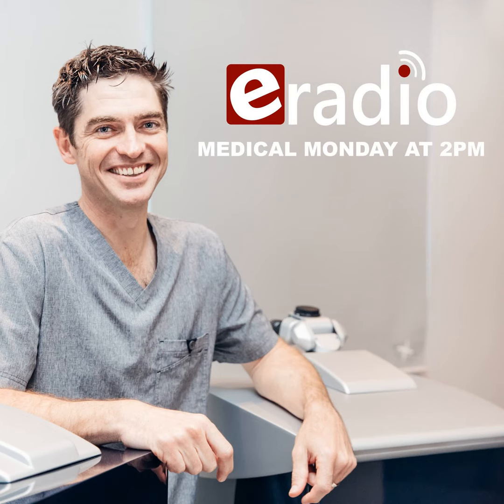LASIK is actually an acronym. It stands for Laser In Situ Keratomileusis. Now that last word especially is a big one. Yeah. And basically it means you're reshaping the surface of the cornea using a laser pulse. And that laser pulse is what we refer to as an excimer laser or excited dimer laser. It actually uses a combination of noble gases, which then emits light rays in the ultraviolet spectrum. And when we look back at keratomileusis, it basically means the reshaping. So we're using these laser pulses to actually reshape the cornea to allow the light rays to fall exactly where we want them to at the back of the eye.